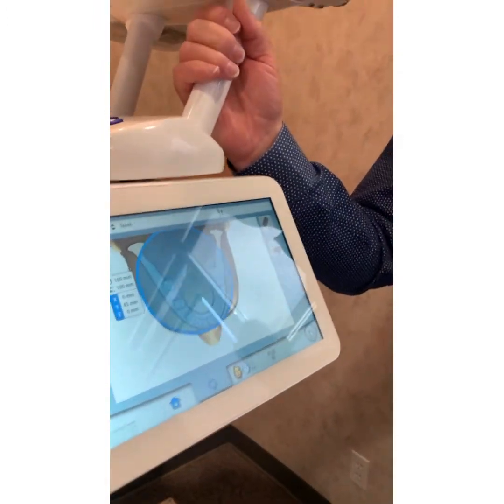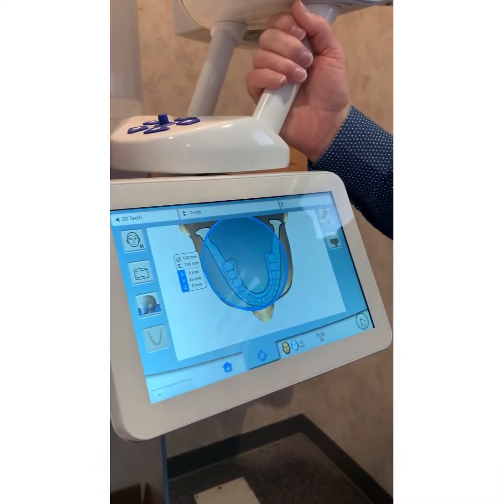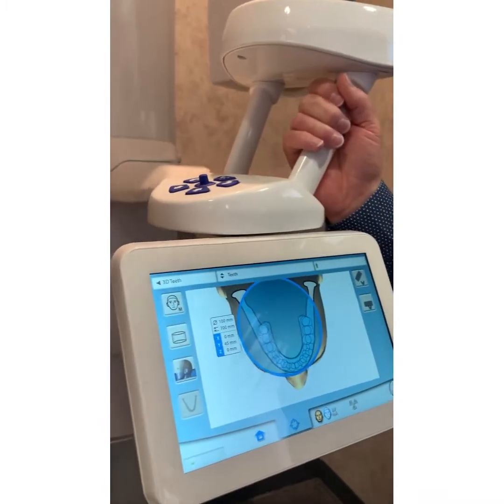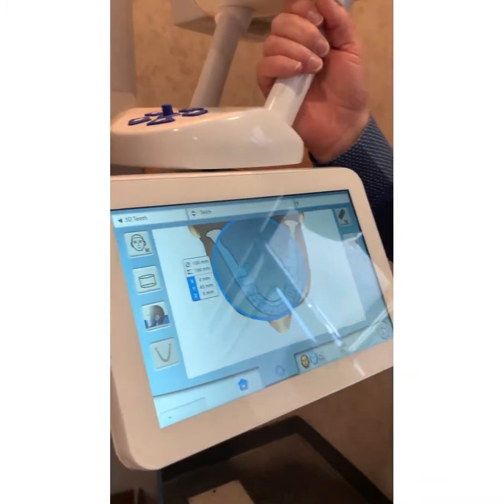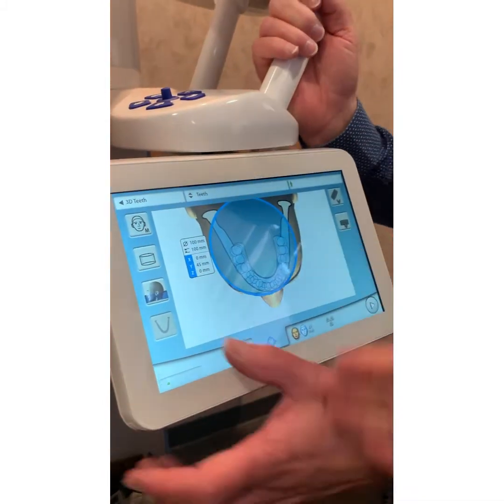When you do an endo tooth, are you going to want it to be singled out like you showed us earlier, a section just for that area, or the whole scan? Oh, I don't care. But that was with the pano. So there's another question. What if he's just looking for the endo? Can you do half the mouth? That little section, this right here.